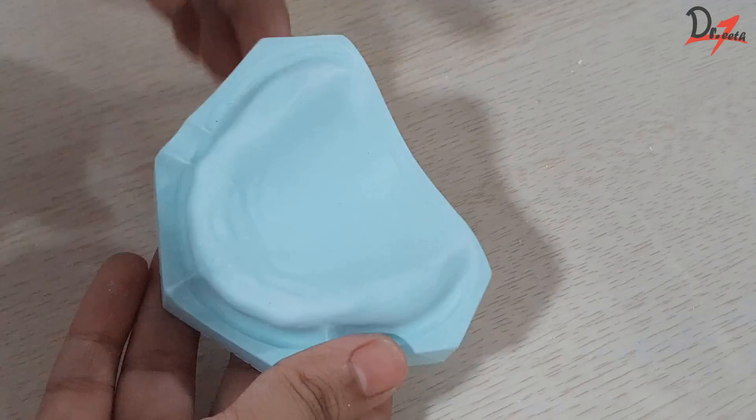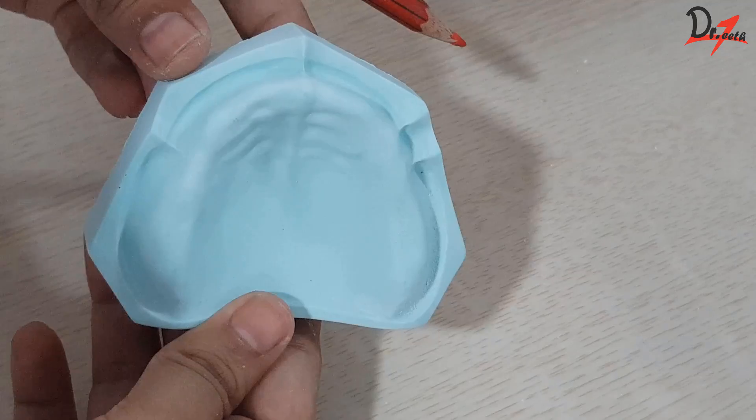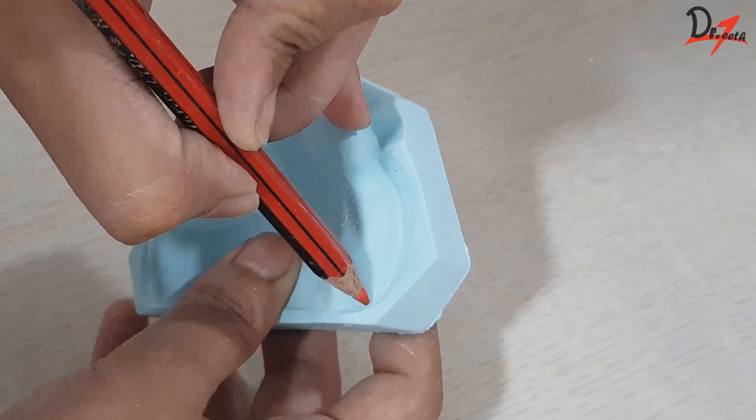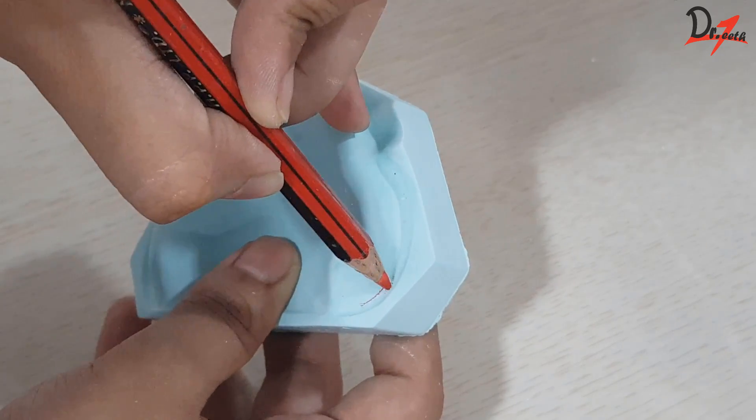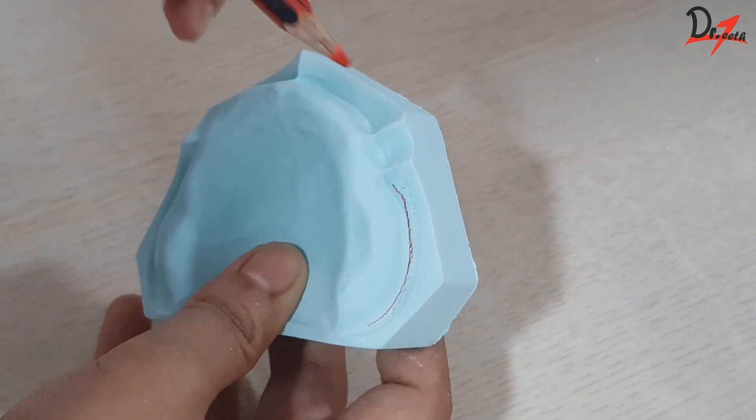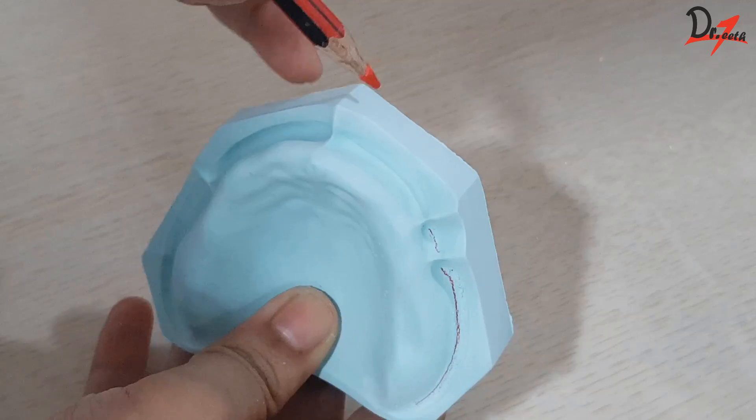So first of all, we will begin by marking the depth of the sulcus. And if you look closely, the sulcus is little wide. Now where to draw it? We have to draw the line where the bone ends and the sulcus begins.